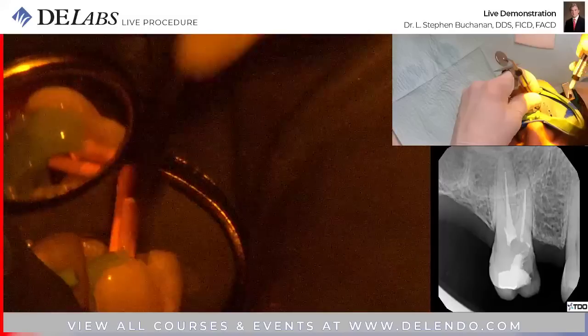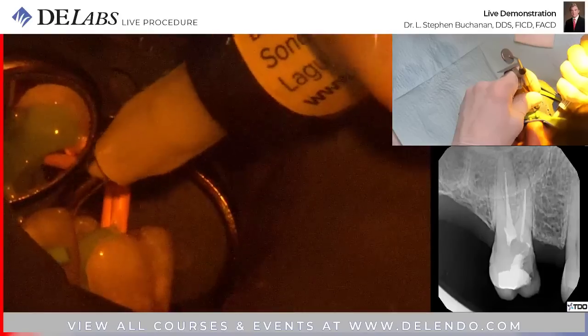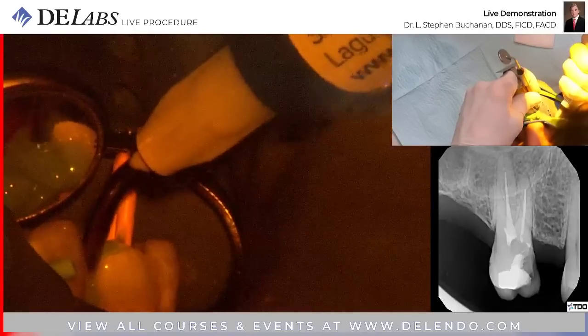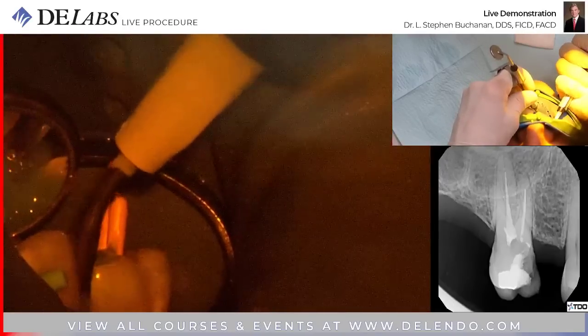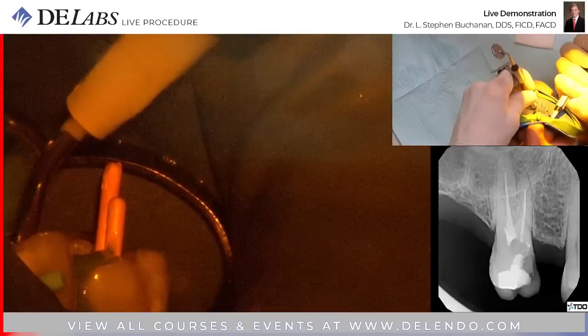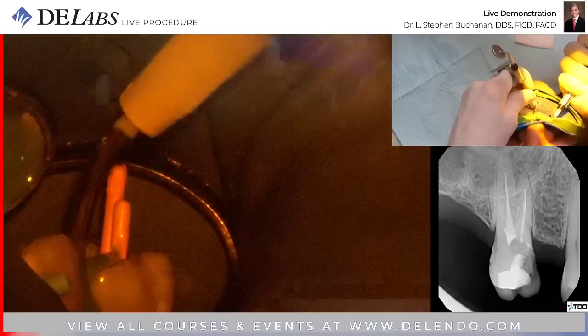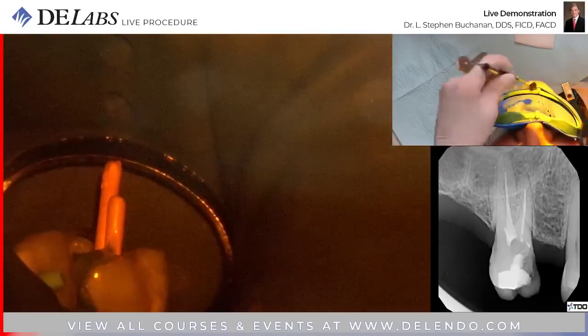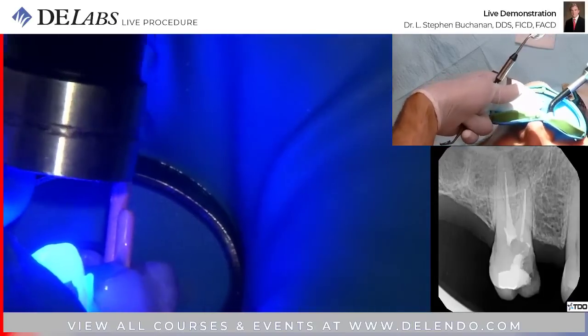A bunch of us in the user group, we were doing these really fine glass ionomer and composite restorations there, and they all blew out. What I found out from that is, you probably knew this, these materials take tens of minutes before they're totally set up. And so when we put the vacuum on it from the GentleWave device, it just sucked air under it and it was gone immediately.